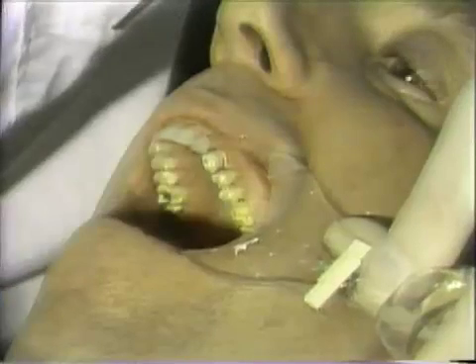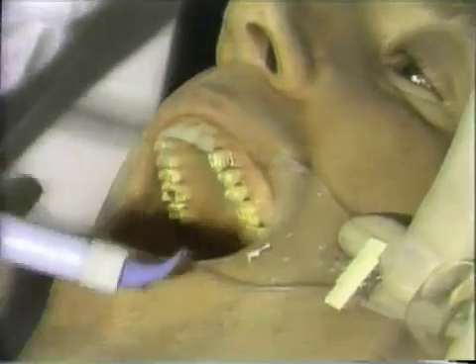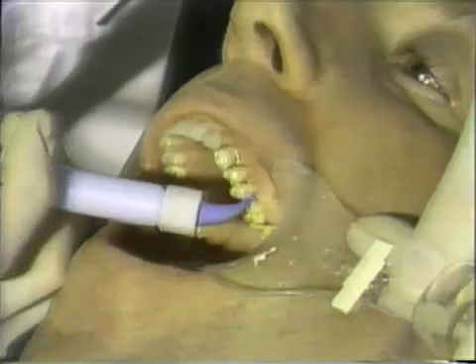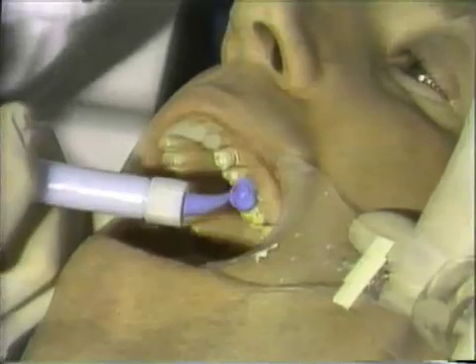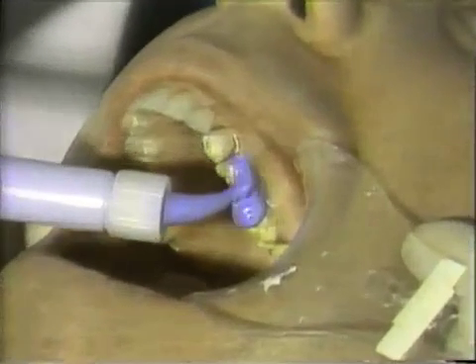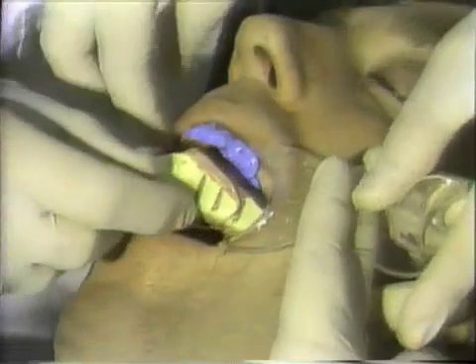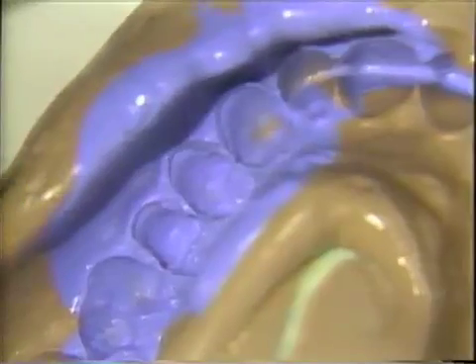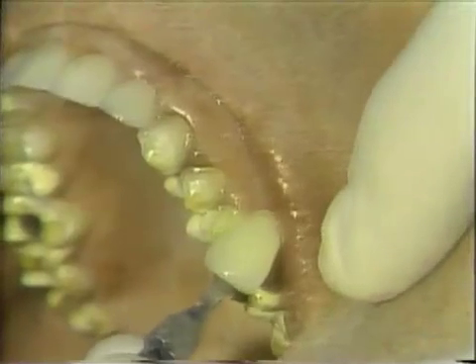Tissue pack is now removed, and a polyvinyl siloxane impression is taken of the prepared teeth. Be careful to inject interproximally and under the soft tissue. Heavy body material then is placed over the top of this, and allowed to sit for 10 minutes. We examine the impression and we look at the clean, clear finishing line. The previous shade then is verified to make sure that is correct.